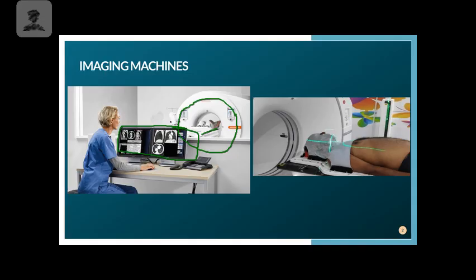So that goes for your console as well. This here is going to be a Siemens machine. They're planning out their imaging, and you can see 3 different body planes right here. We're only going to image what is necessary for the doctor to create their treatment plan. We'll scan through all of that, and do any changes that might need to occur. Then we will send those images on to the doctor.